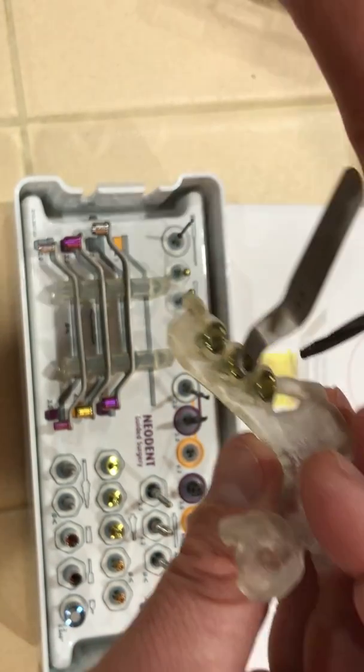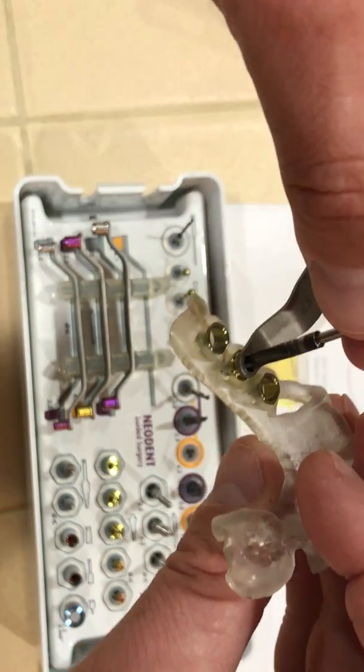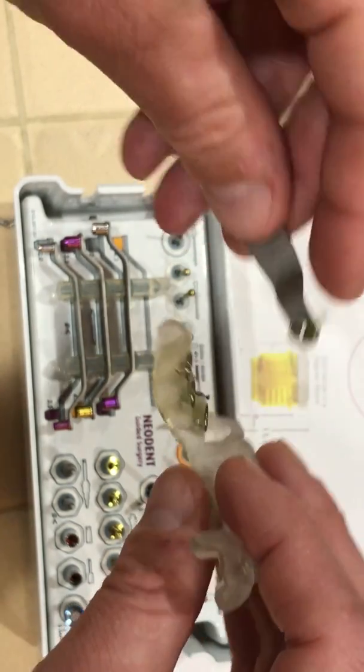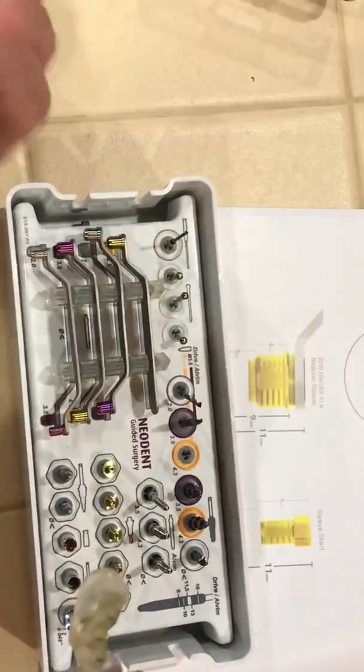If I push this thing through and I'm not paying attention as the doctor doing the procedure, it could go all the way through. So you can get endo stops if you want, even from somebody like Salvin.